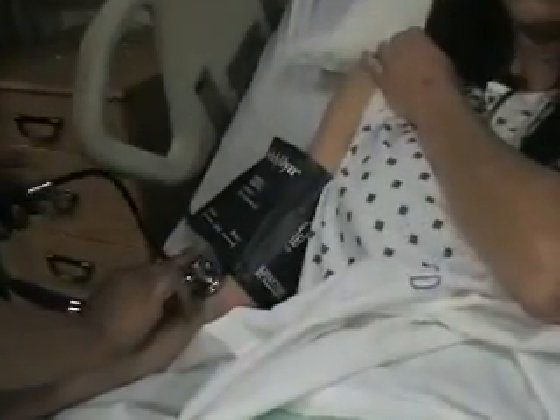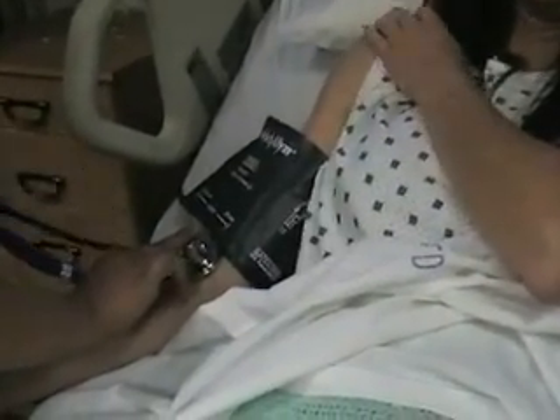What is your normal blood pressure? About 120 over 60. 120 over 60? So then we'll pump it up to 150, about 30 millimeters of mercury higher than what your blood pressure normally runs.